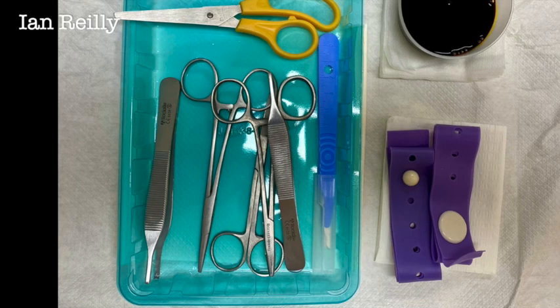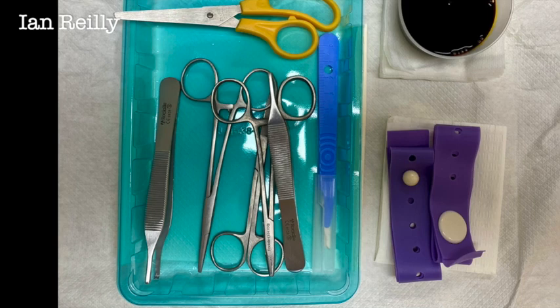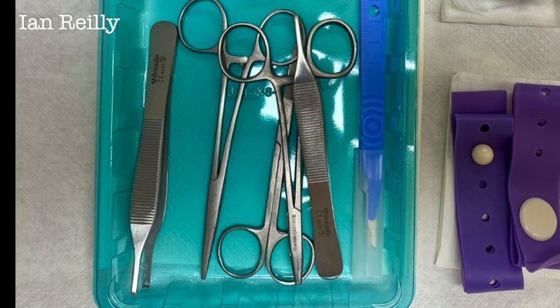You can also combine this, as we've done in this case, with a little bit of electrocautery which just helps with post-operative bleeding, and then just a standard tourniquet and sterile setup.